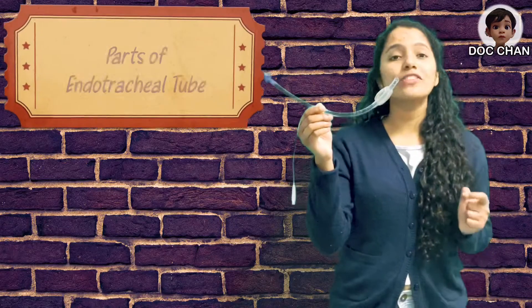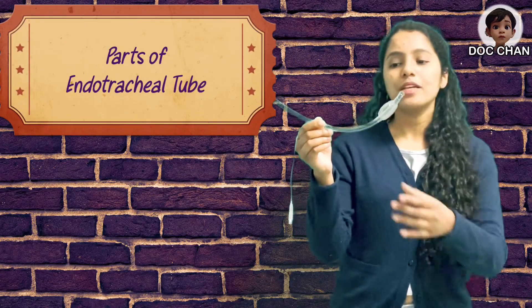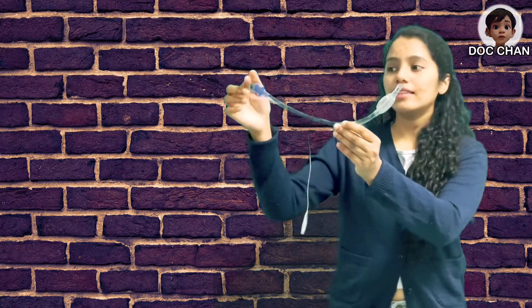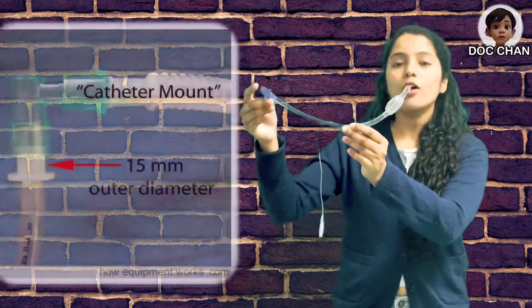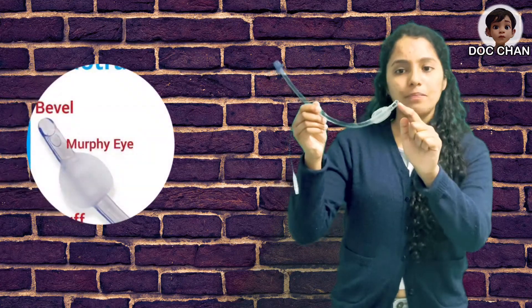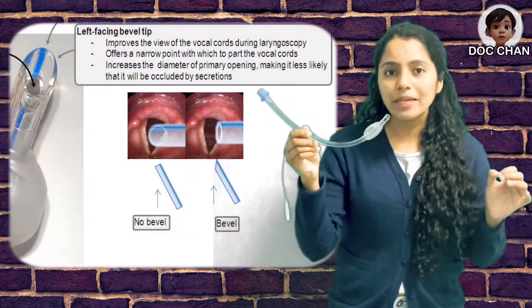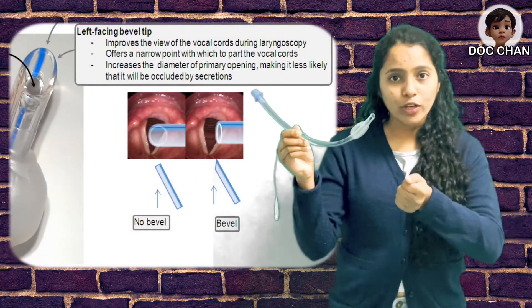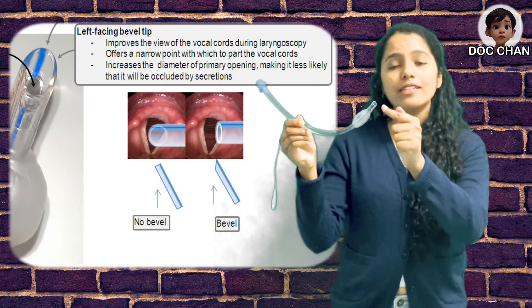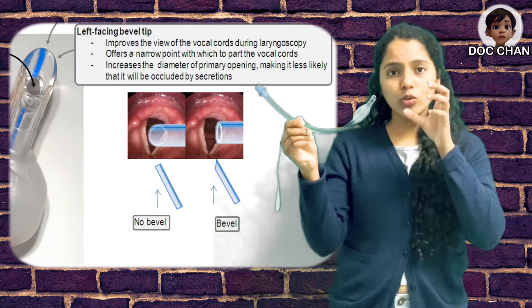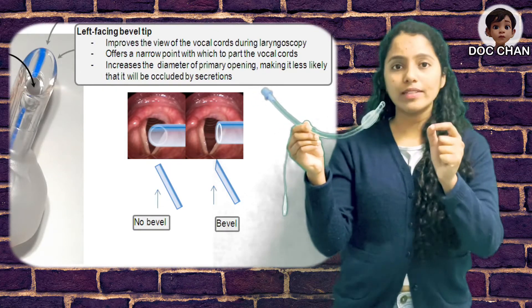Let's first discuss about different parts of the tube and its function. So if you can see the tube, it has got a patient's end and a ventilator end, or it can be connected to an ambo bag or a Bain circuit. This part is called the bevel and this bevel is facing towards the left side. When you're intubating a patient, you take the laryngoscope in your hand and start intubating from the right side, and this bevel is towards the left side such that when you look at the vocal cord, you'll be able to visualize it properly.